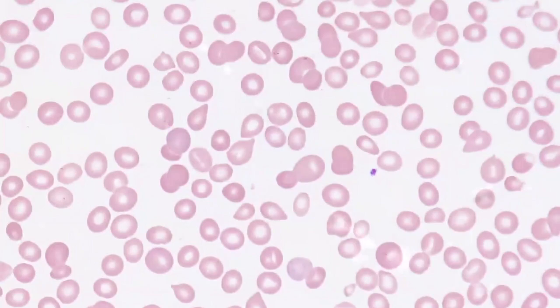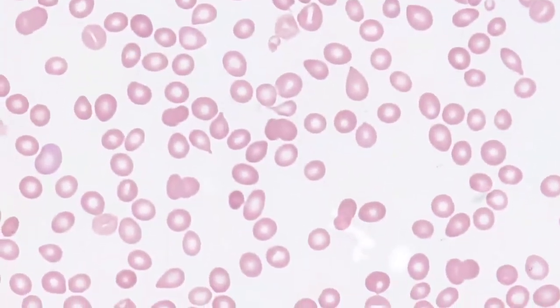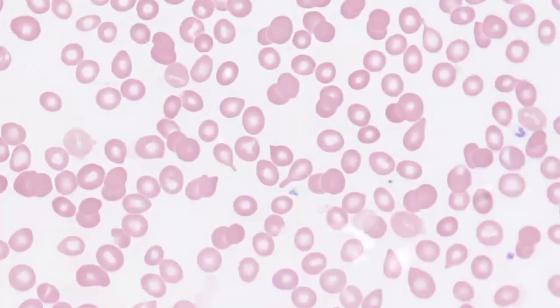These can be seen artifactually in cases where the peripheral blood is smeared aggressively over the slide. In these cases of artifactual dacryocytes, all of the teardrop shapes will be pointed in the same direction. However, in this case, we can see that the teardrop-shaped red cells are all pointed in separate directions, indicating that this is not an artifact of the smear preparation. Here's two really good examples of dacryocytes.